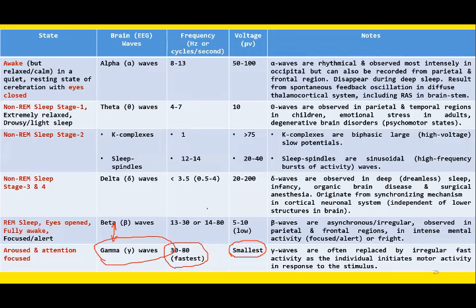So this is all for today. Today we discussed electroencephalography. Electroencephalography is the procedure in which we record the electrical activities of the brain by placing different electrodes over the surface of the skull. And the graph that we obtain over the paper strip or over the oscilloscope screen is known as the electroencephalogram.